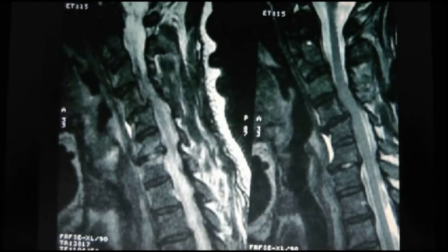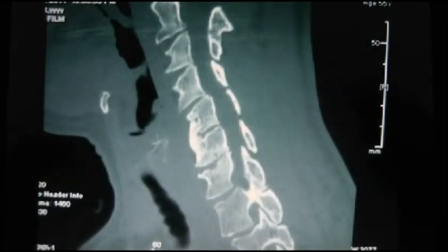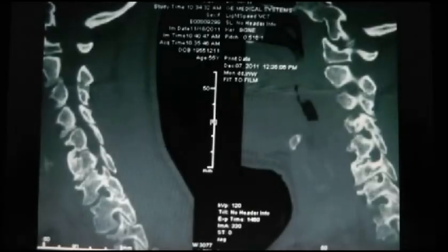Can you explain that? C5-6 doesn't have much osteophytes, does it? But C6-7 does. Why doesn't C5-6 have osteophytes? Because it's fused. It's not moving, so it didn't deteriorate. So she deteriorated at 6-7 because C5-6 is autofused. So you can see that C5-6 somehow autofused, and she's developing deterioration both above and below that level.